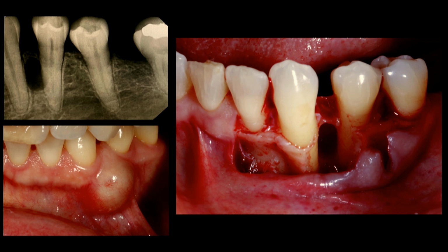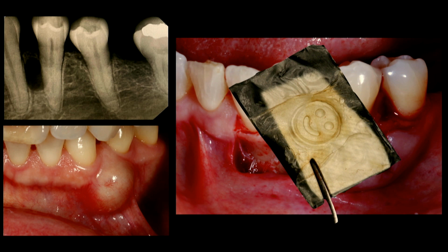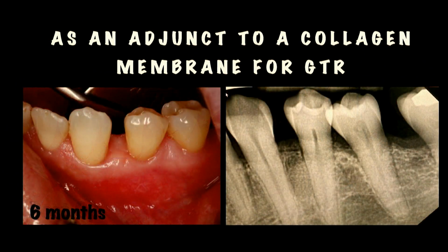Again, using the Amnion-Chorion against the root surface is a great way to go, but I also want to maintain a little bit more space here. So in this case, I actually did use a collagen membrane as well, which helped to keep a little bit more substructure. You'll see we can use sticky bone, we can use a lot of other things to maintain space. I still tend to like using a collagen membrane in addition to this when I need to build out outside of the housing. And in this case, I do have some pretty good follow-up. This is immediately post-op. And then we have a view at the 6-month post-op.